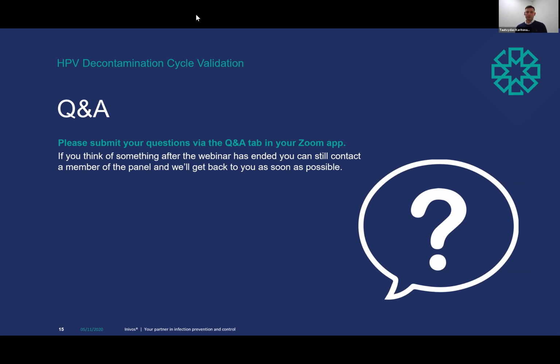So the future is that once we get on top of understanding exactly what decontamination cycle parameters are required, we can improve and further reduce the concentration of our starting solution, making it safer for the operator while achieving the same high level of efficacy, and then combine that knowledge to develop the shortest process time. Because as soon as you get the right level of efficacy, you then have hydrogen peroxide to deal with. At the end, you need to deactivate, and that's the next phase where we're hoping to invest more time and knowledge to see how we can shorten the process time, knowing those cycle parameters.